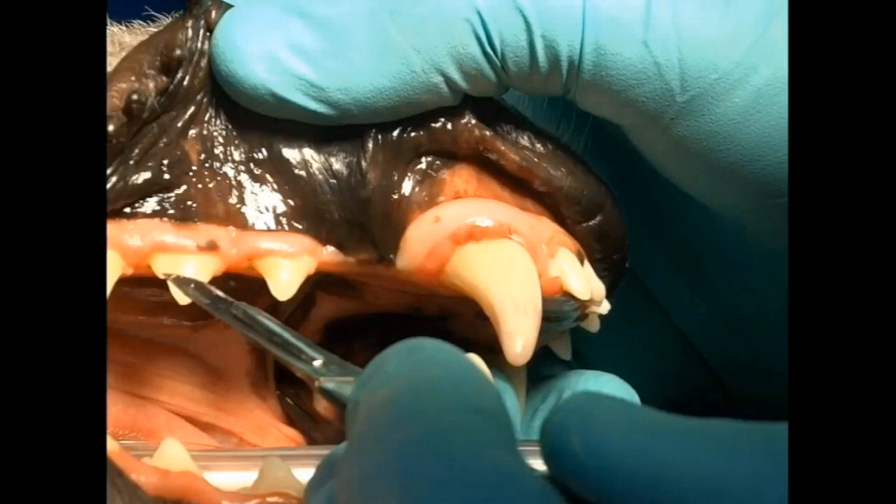So in general, for most extractions, the position most of the time — and I'll tell you the exceptions — but most of the time is with the crowns facing us.